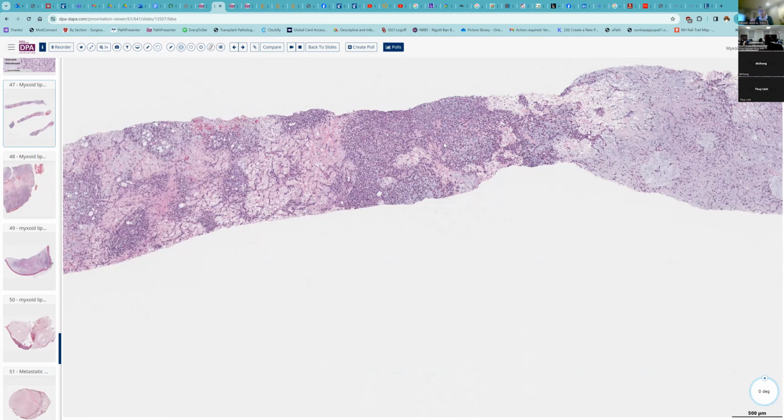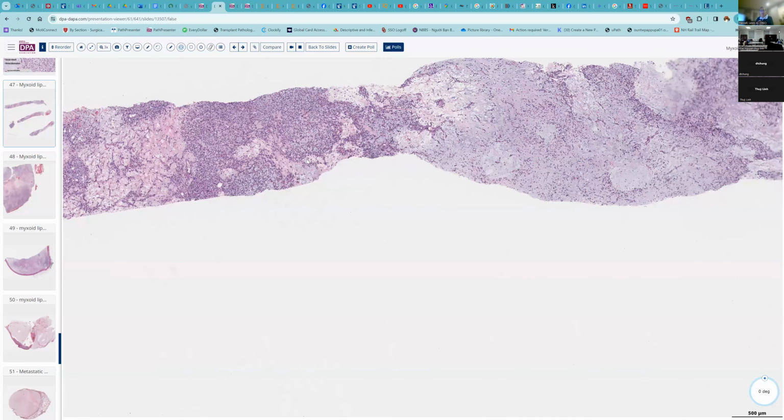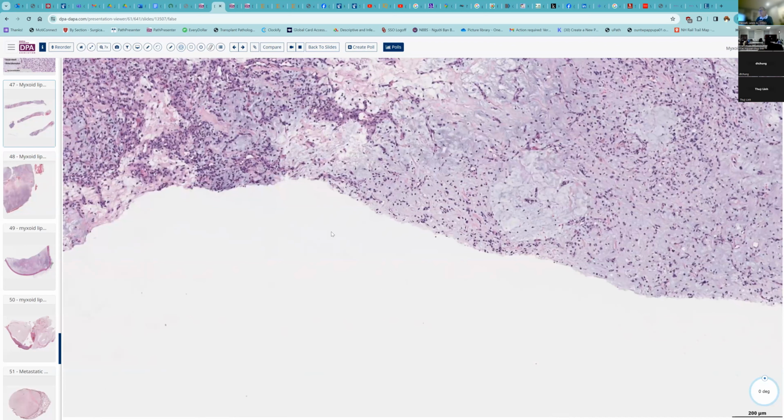Synovial sarcoma, very uniform tumor with low-grade atypia. And so myxoid or round cell liposarcoma is like that in that it has a fusion gene partner that gives you this appearance. And now look at, here's the example of one of these tumors.